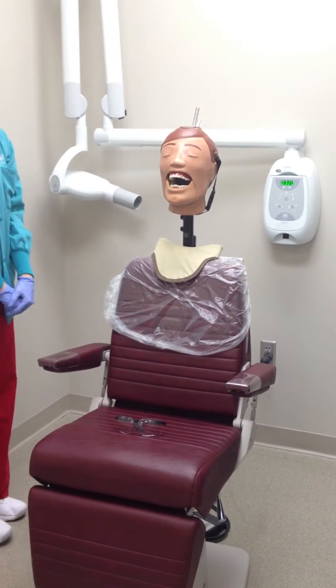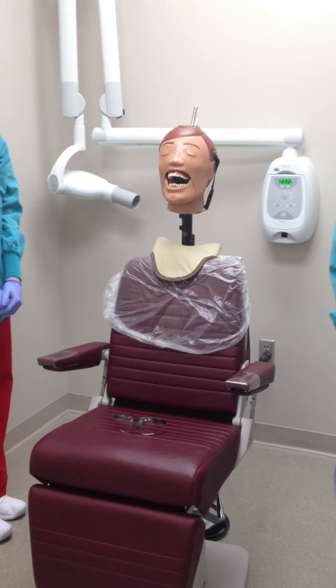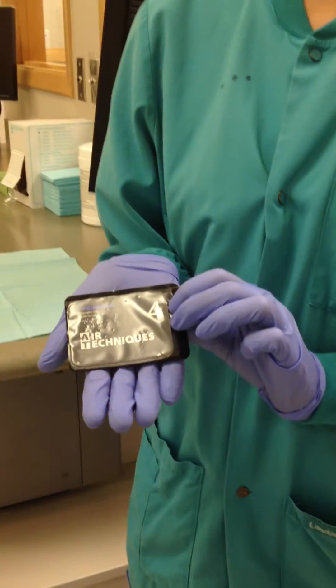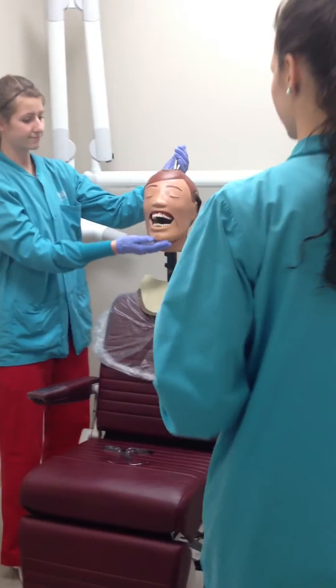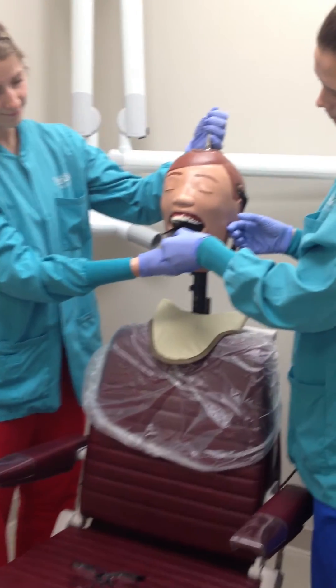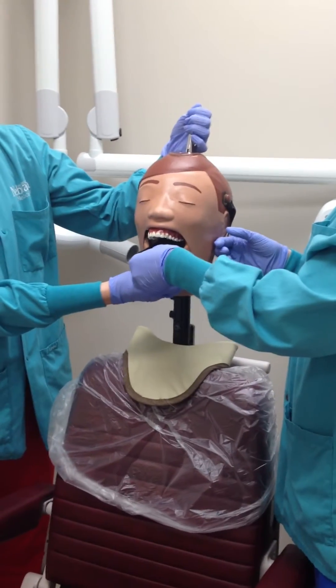When taking a mandibular lateral occlusal radiograph, a size 4 film or phosphor plate is used. The film or phosphor plate is positioned with the long axis parallel to the facial surface of the posterior teeth, with it extending a half an inch beyond the buccal surfaces.